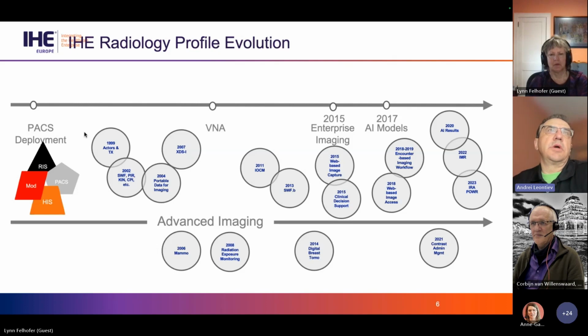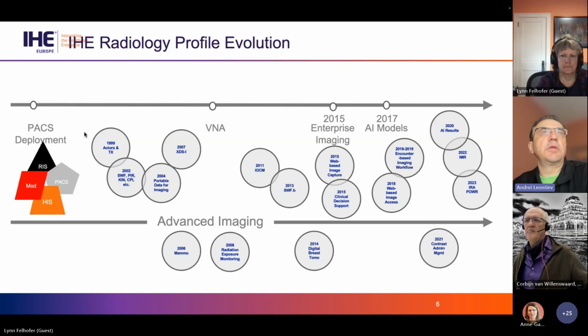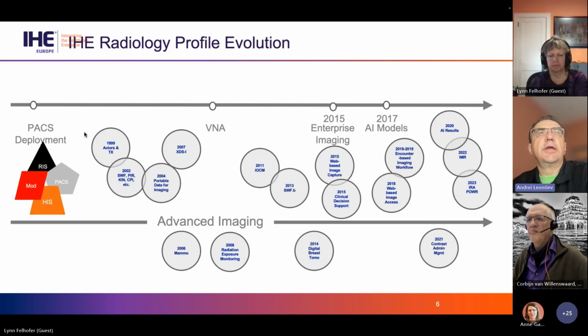As everyone knows, IHE Radiology was essentially a starting point of the IHE process more than 20 years ago. We started looking at the integration in healthcare in terms of making the systems work and talk to each other between, back then, HIS, RIS, modalities and PACS, which with the times formed into slightly different product categories, but some of them could still be recognized.